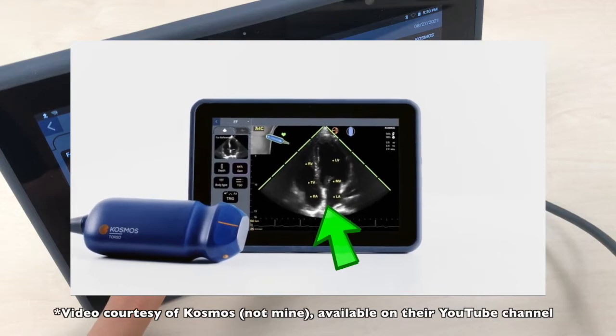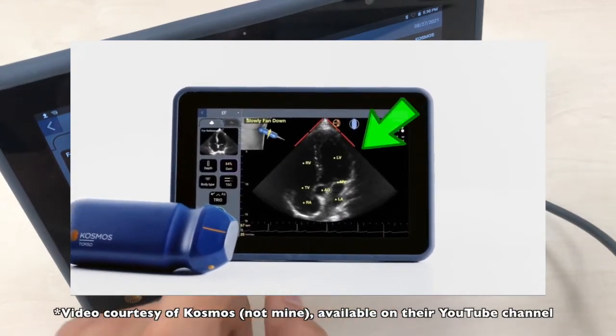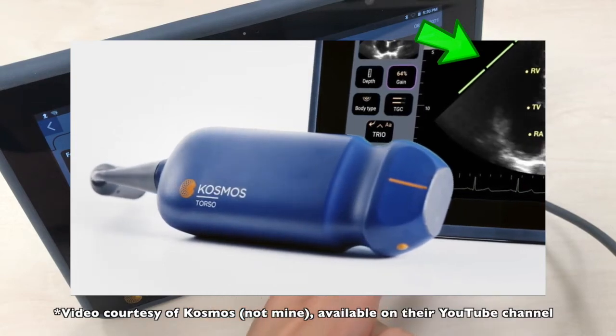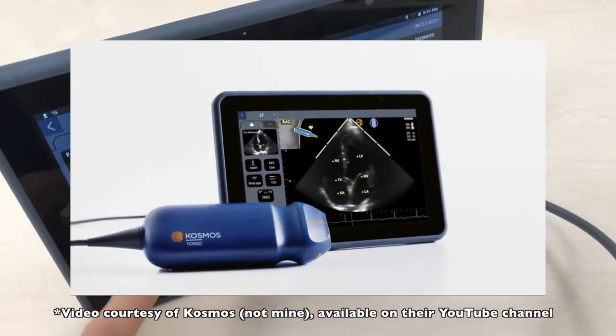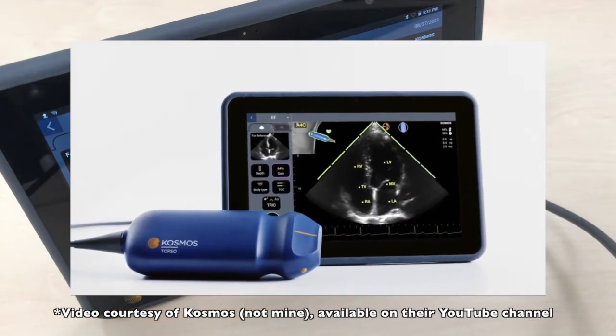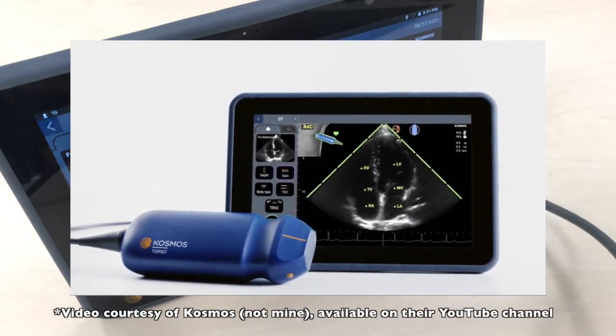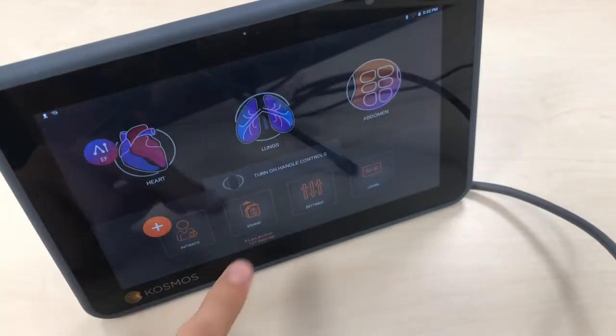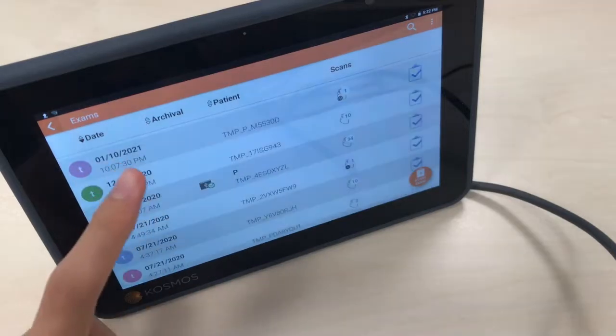Then you have the autograding, which is this scale. Based on image quality it will become greener and move toward the bottom. And the last tool is the autoguidance, which helps you position the transducer correctly. Then you record the apical 4 and then an apical 2, and I'll show you what it obtains.